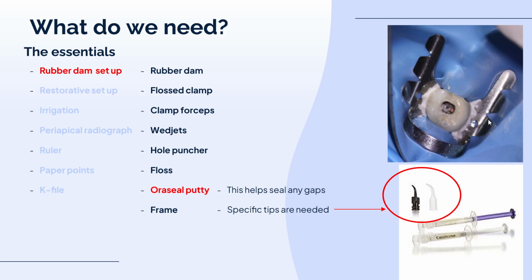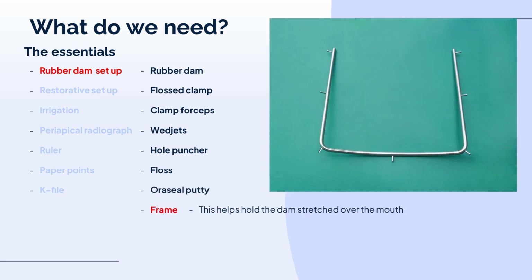Some DAs say, oh, somebody must have put the wrong tip in there before they put it into the drawer. Doesn't matter. You're handing it to the dentist. Make sure you put the right tip on there. And I always encourage all my dental assistants just to squeeze a little bit onto a bib or a paper sheet, just to make sure there's no blockage, and make sure it flows, because you don't want to hand the dentist something that's blocked. Otherwise, what's the point? Make sure it works. Make sure the right tip's on there.